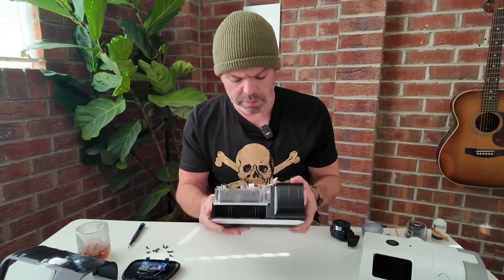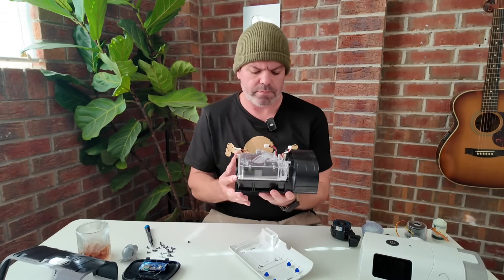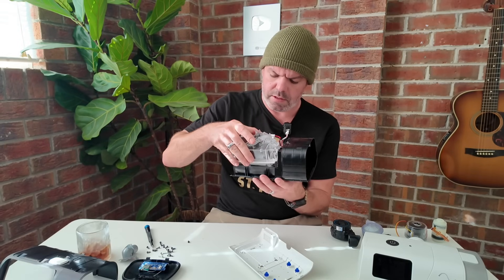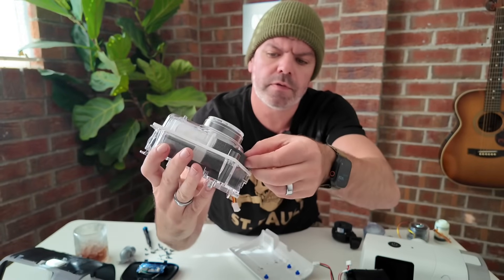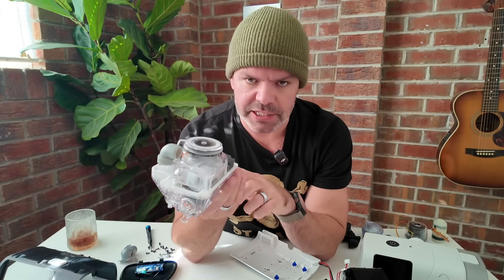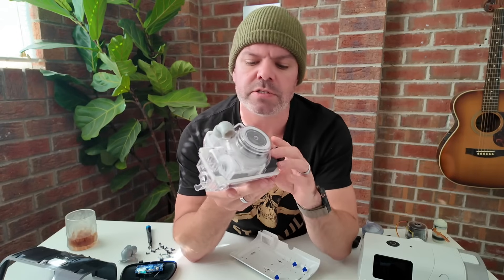I wasn't sure if I could take this apart further, but here we go. This is the blower compartment here. And this is the sound abatement foam. CPAP manufacturers use this foam to reduce machine noise so it's quieter and easier to sleep with — they pack it in around the blower, and it's also inside the device to soak up noise and stop vibrations.